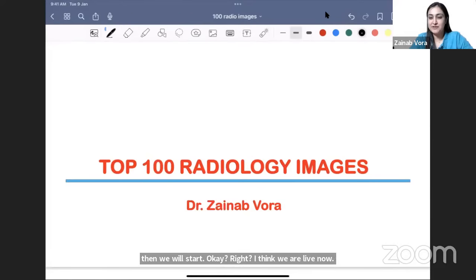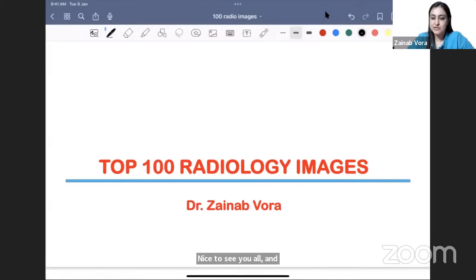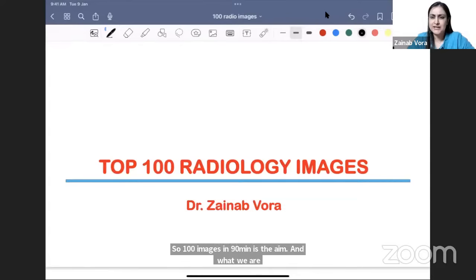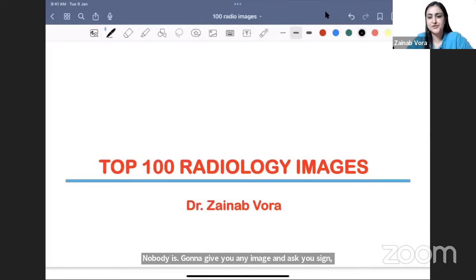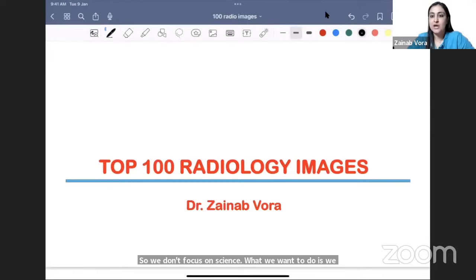Good evening to everyone watching on Zoom and on YouTube. We're going to be discussing the most important images — 100 images in 90 minutes is the aim. I've written the history on top of the images, you tell me the diagnosis, and we discuss what could be the potential questions. Most radiology questions are asked in an integrated fashion; nobody just gives you an image and asks for a sign. We focus on images and the pattern approach — how not to get confused. No other subjects today, only radiology.